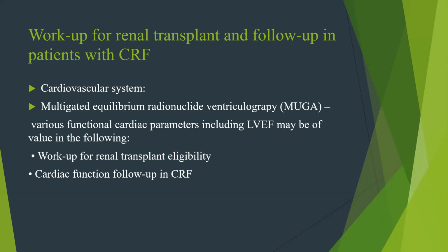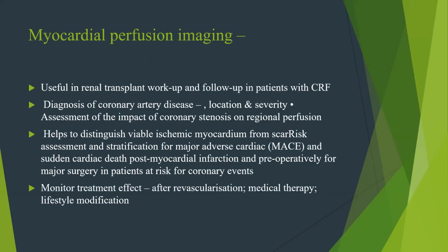So we can do a MUGA study in which we study various functional cardiac parameters, including the LVEF, which may be of value in case we are thinking about workup for a renal transplant eligibility, and also in cardiac functional follow-up in cases of CRF. We also do myocardial perfusion imaging in these patients because this is useful in renal transplant workup and follow-up.